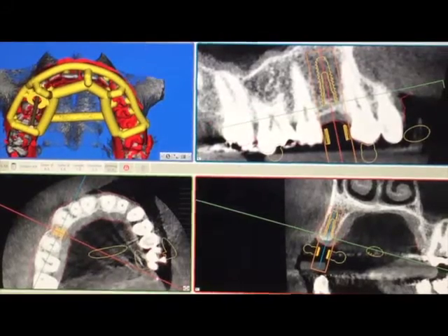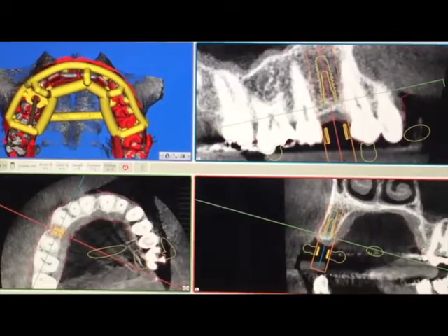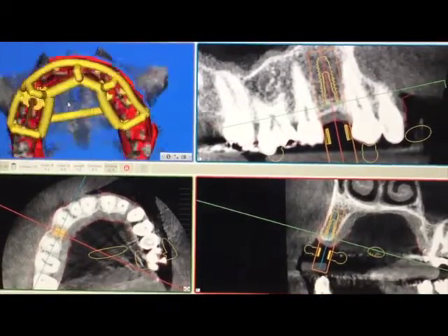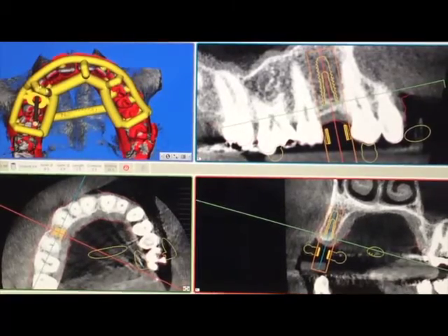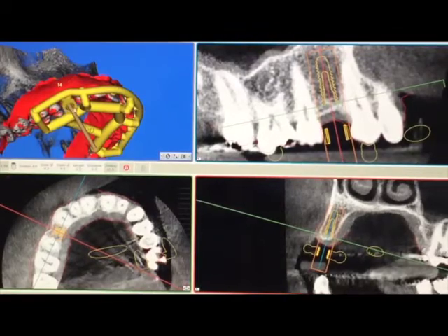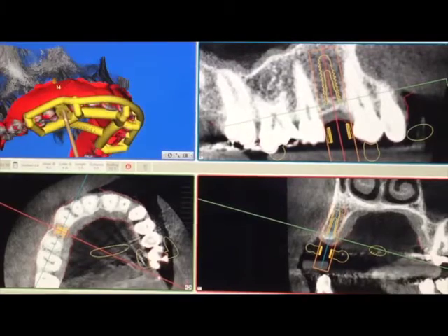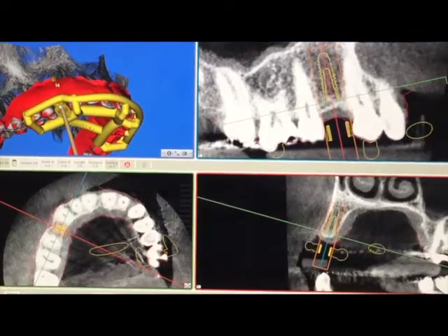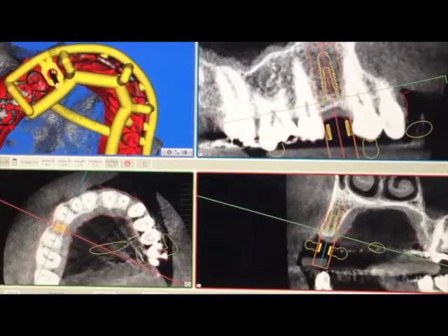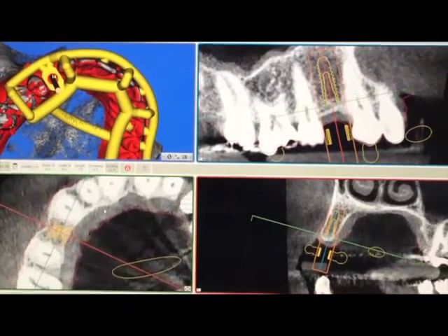Hi, so this is the SMOP software, and on the top left here we can see the 3D CT scan and the guide that's been designed by the lab, by Hugo from Nimrodental. And this point here is the angle of where the implant's going to be placed, and you can see that this is where the key is going to sit in, and that's what's going to give us the accuracy. And the other three screens are the different planes of where we designed the implant.